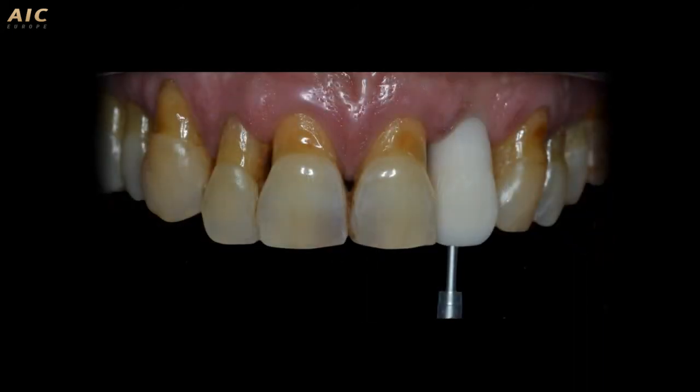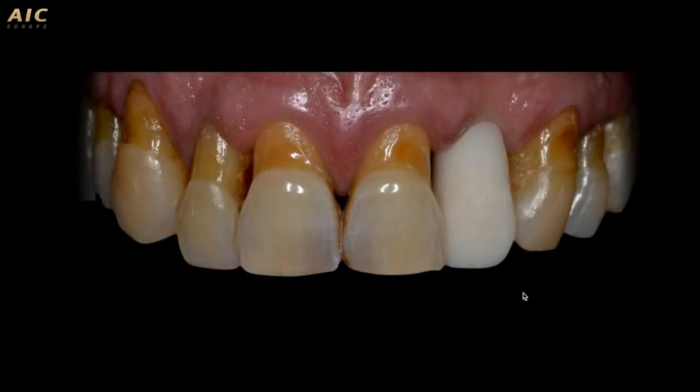This is the aesthetic result of the try-in of our prosthetic project, and we like the absence of the screw hole, because thanks to the angled screwdriver we translate the hole of the screwdriver to the palatal zone of the crown.